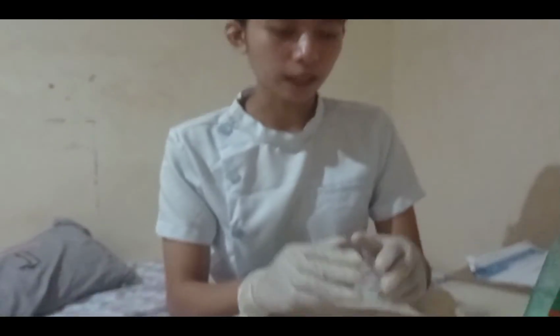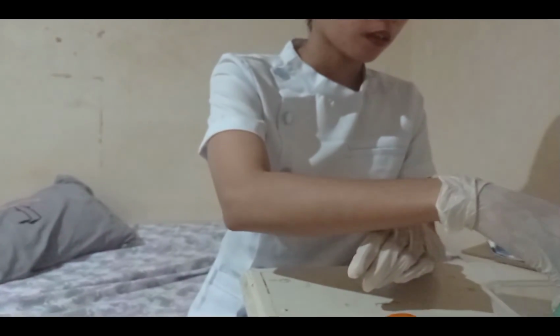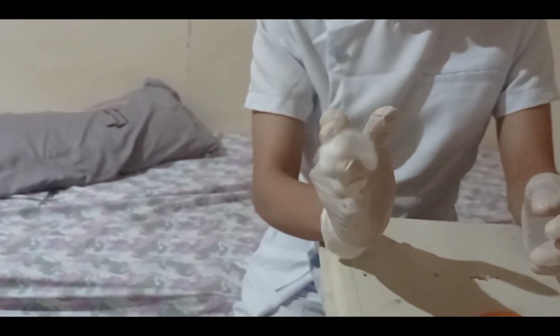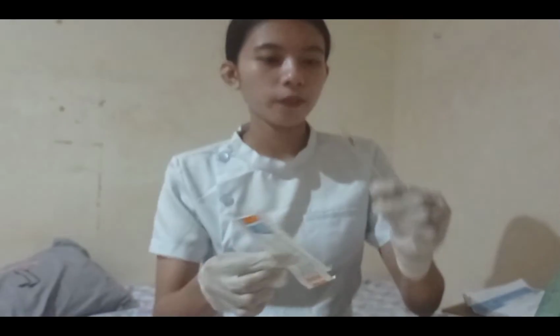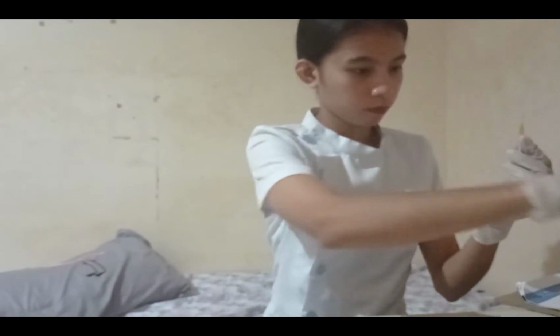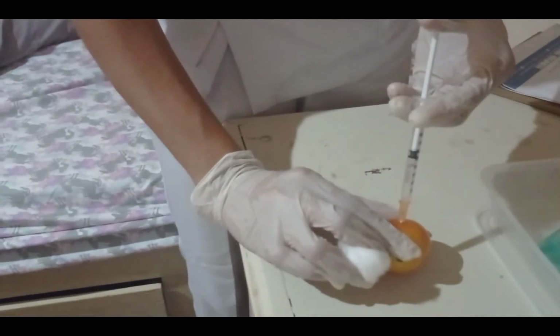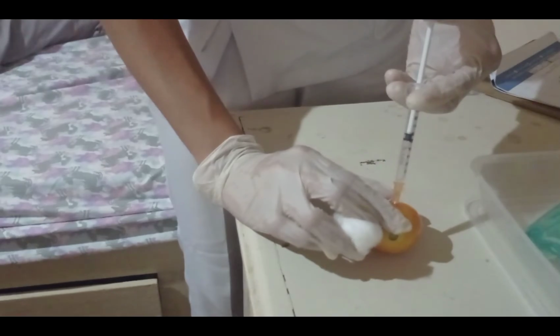After cleansing the site, we place a gauze or cotton ball between the third and fourth finger of our hand. After we remove the cap of the injection, we hold the syringe between the forefinger and the thumb. With the dominant hand, inject the needle quickly into the muscle at a 90-degree angle, using a steady and smooth motion.